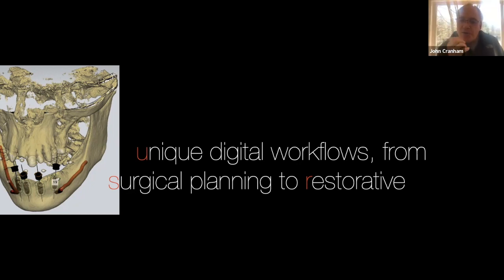How would you recommend this? Let's say you do a PMMA digital denture and they wear it for 3 or 4 years, and then the ridge changes and they need a reline. How can you reline these things? Can you reline it, or can we do a lab reline? Could we put in impression material? Yeah, absolutely. Okay. Yeah, no question, no problem.